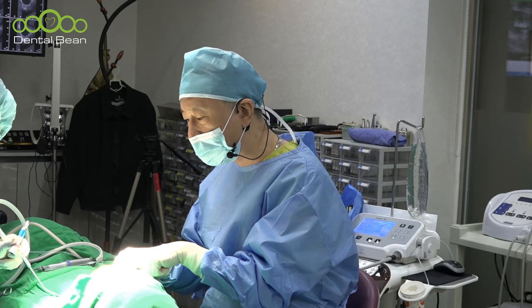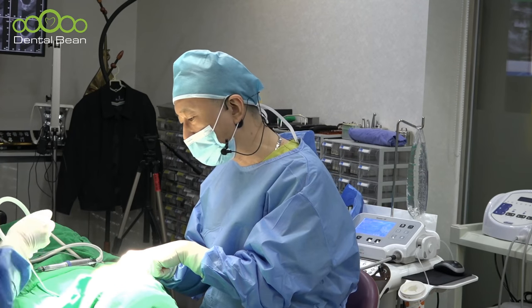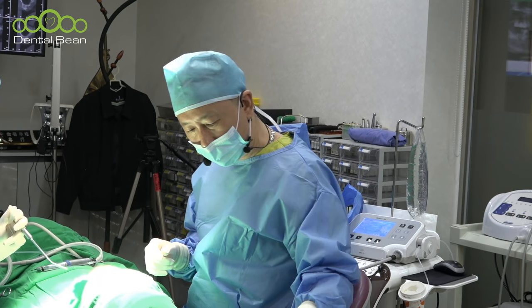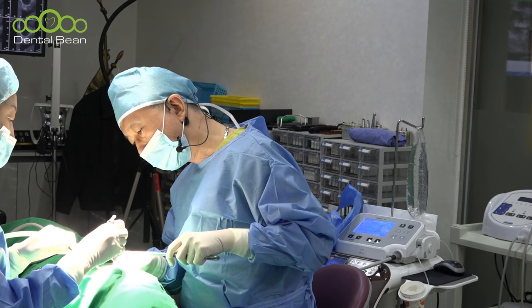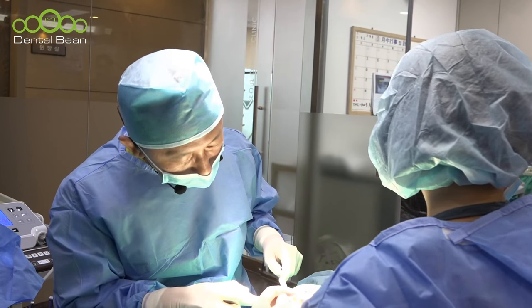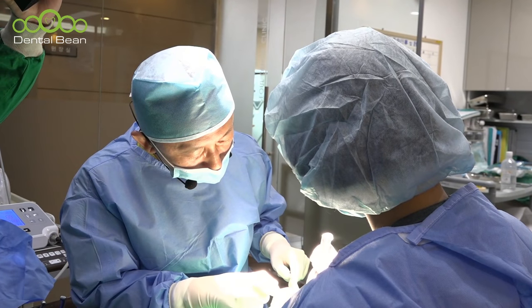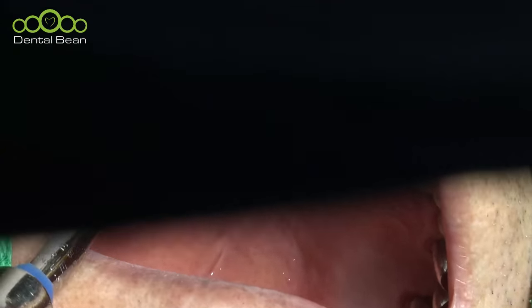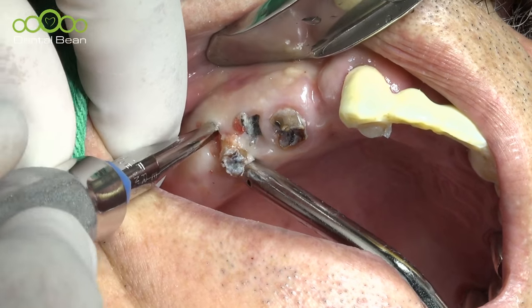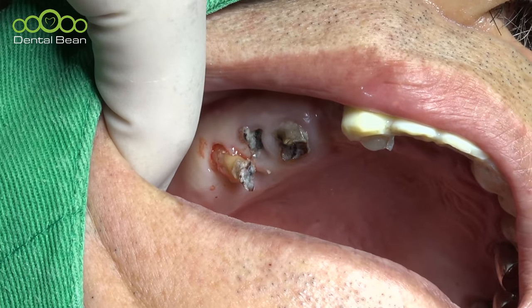So for the incision design, I want to try the conventional incision design, the trapezoidal flap from the mid-crestal and then the vertical incision. Okay, I want to start the first patient. Some root rest. Usually, for a successful immediate placement, it requires careful tooth extraction first.